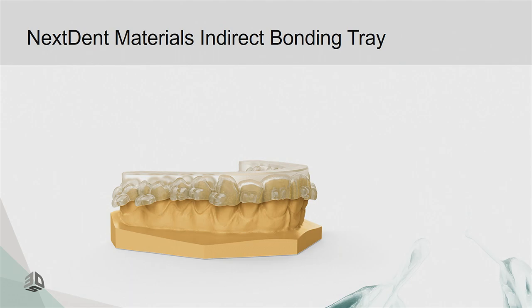Indirect bonding tray, a little bit of explanation. This is a flexible material that makes it possible for the orthodontist to place each and every bracket in one go. You go into the software, you place the brackets, the software will help you with that, and then the orthodontist will continue in the same software and design an indirect bonding tray. That tray will be printed, and then in the tray you will place the brackets, and then they can be glued in one go, saving a lot of time in the chair.